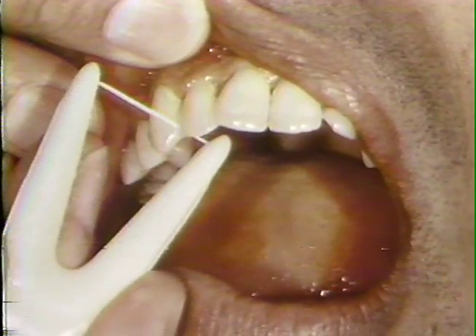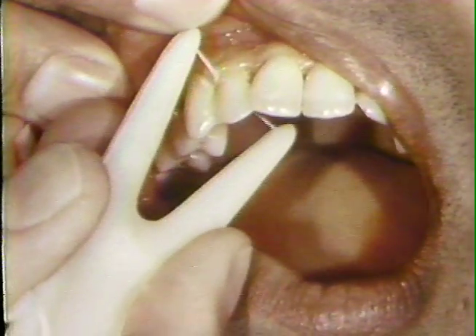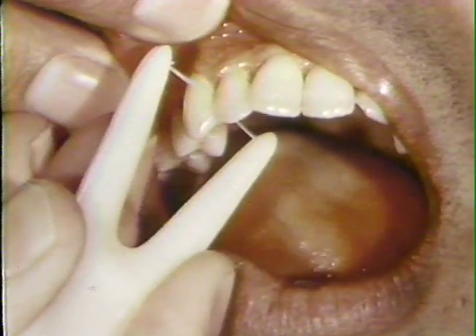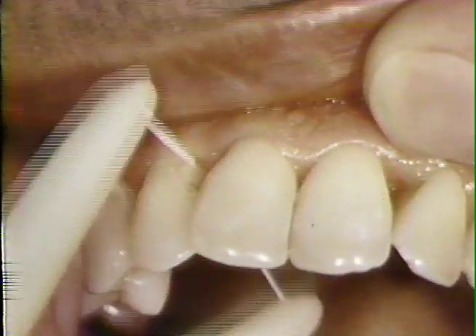The patient is also re-instructed in the use of dental floss for the interproximal areas which he had not cleaned efficiently. Here, a floss aid device is used to hold the dental floss. Notice the interproximal polishing of the teeth with the floss.